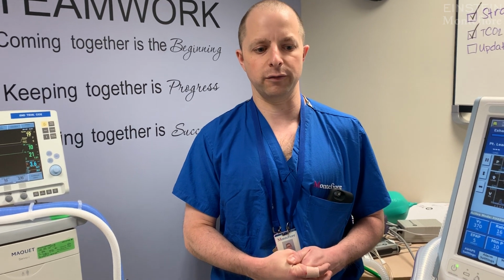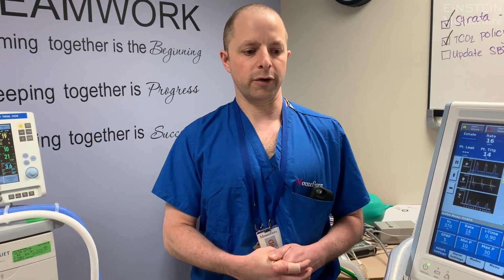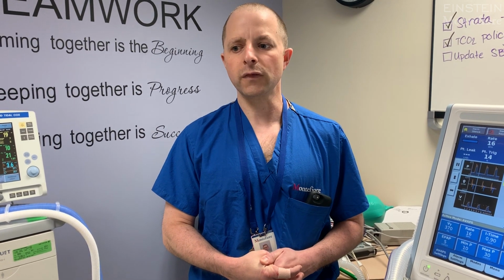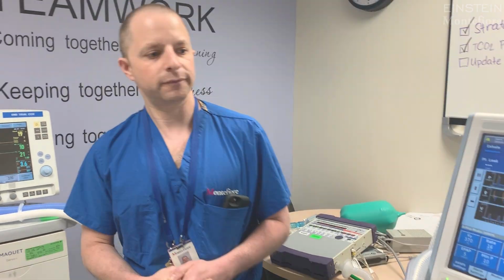Oftentimes the answer is to disconnect them from the ventilator or slow down their respiratory rate. We should always take caution when we're doing these types of interventions during the COVID-19 pandemic to make sure we're wearing proper personal protective equipment, and that if you're going to apply an ambu bag to a patient, an appropriate viral filter is connected. So let's go through our first case.